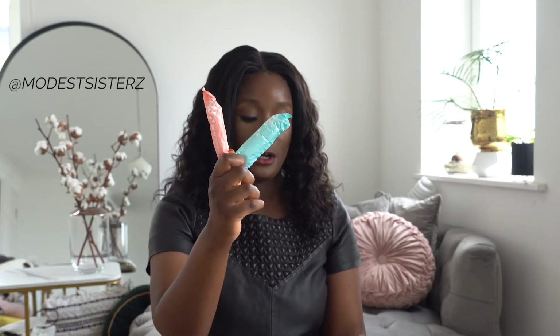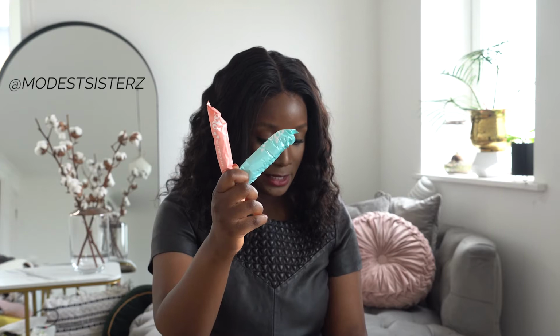I moved on to them after I spent years upon years using Tampax Pearl. So this is a Tampax Pearl I could find in my house, and this is a medium, and this is a medium from Flow as well. So I'm going to open them. I'm doing this to explain the different sizes, so that we can then compare this size that enters to the disc, because the disc, personally, I believe is, if not the same size as the regular tampon, it may actually be smaller. So that should answer your question in terms of it being intimidating to insert.